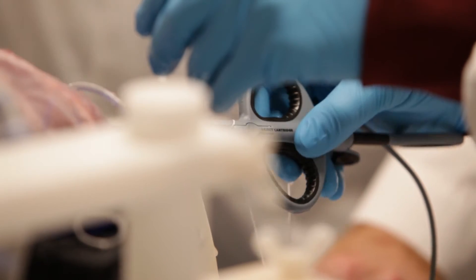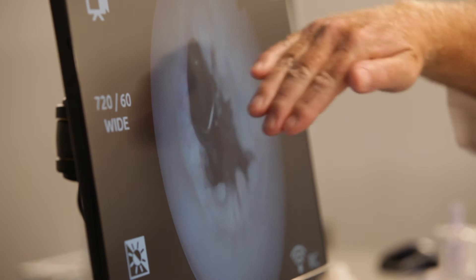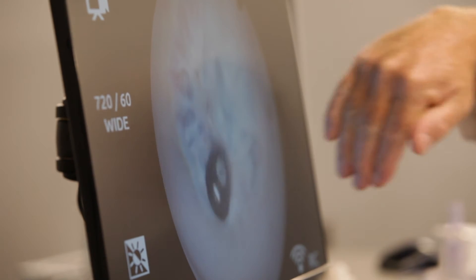Now we're going to come on the other side. Now I'm just going a little more counterclockwise. You want to come from this angle here. Lower it. I didn't even know there's a pre-order. You're not there yet — I'm going to capture this.